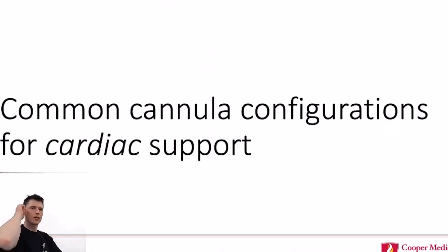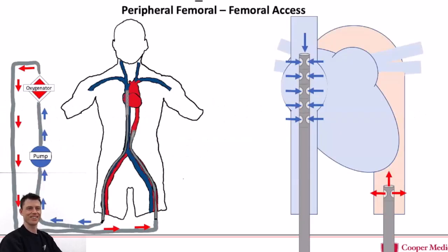All right. So what about for VA? So this is where things, especially with Dr. Minicata, can get really interesting. So VA ECMO, the simplest way to think about it is you have peripheral VA ECMO. What we're doing is we have our drainage cannula that's in a similar position to VV. Sometimes we advance it further, so it tries to capture all the blood from the upper body and lower body. Then we drain that blood there, we put it to ECMO, and then we put it back through the femoral artery. So coming through the groin, up into the aorta.